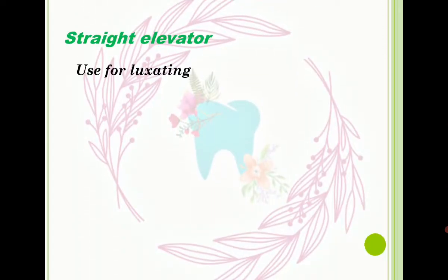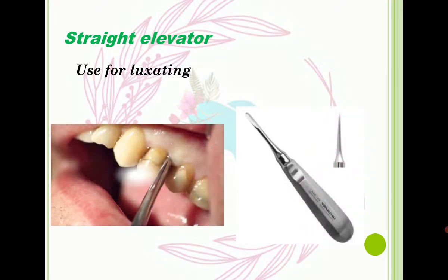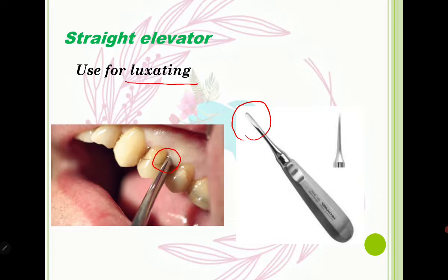The first elevator is called a straight elevator and it is used for luxating. Pay attention to the blade of a straight elevator — it is inserted under the gingiva and we can start luxating. This movement — luxating — decreases the attachment between the PDL and alveolar bone, so the tooth will be ready for extraction.